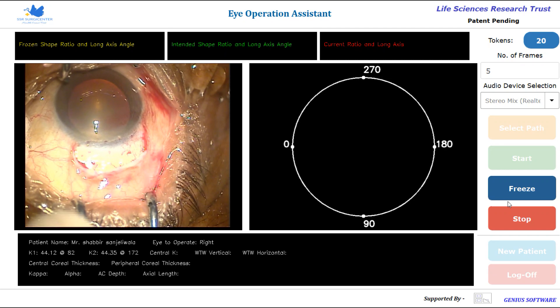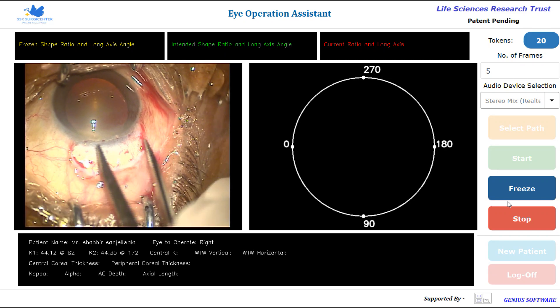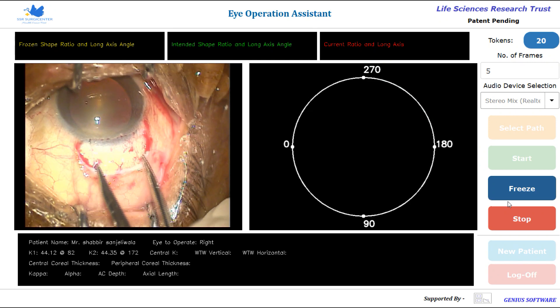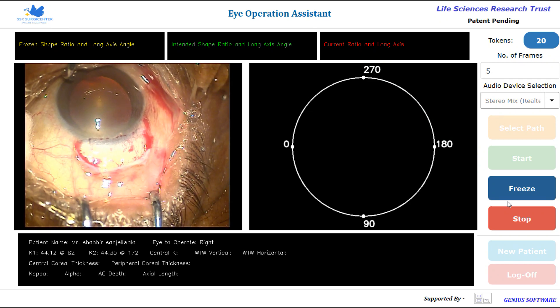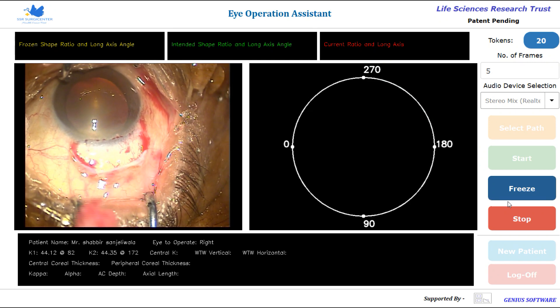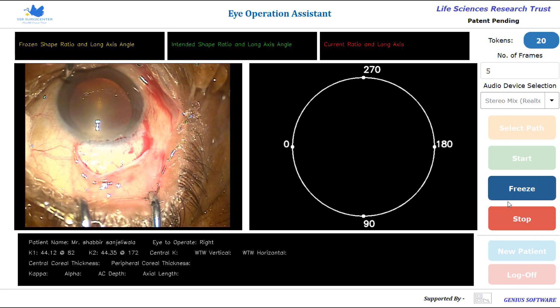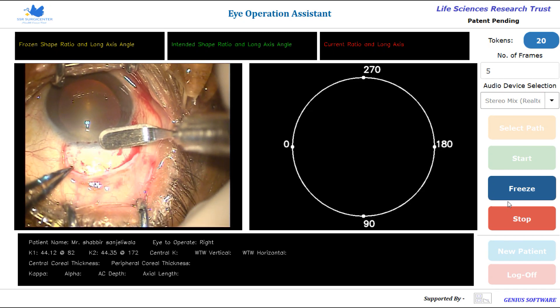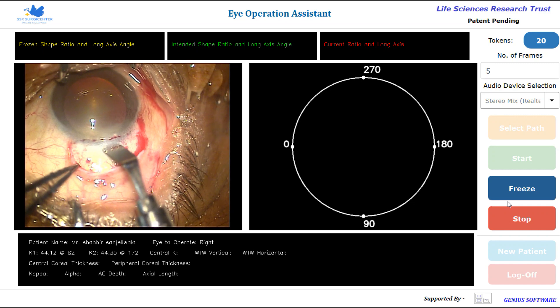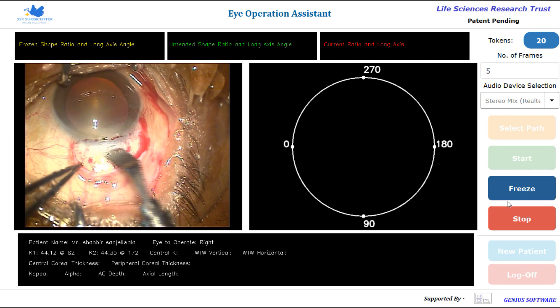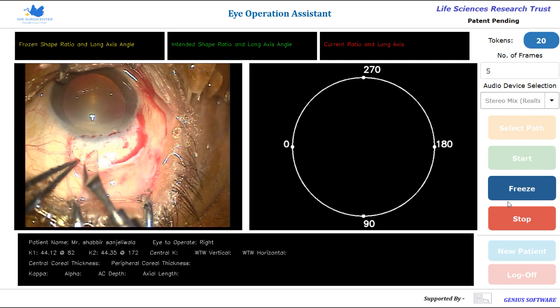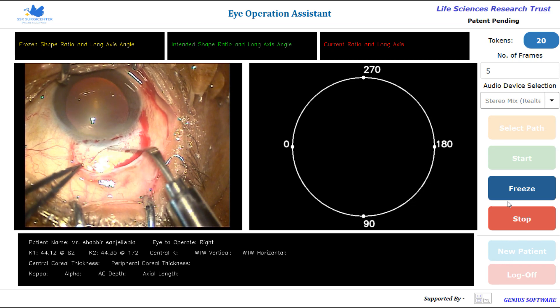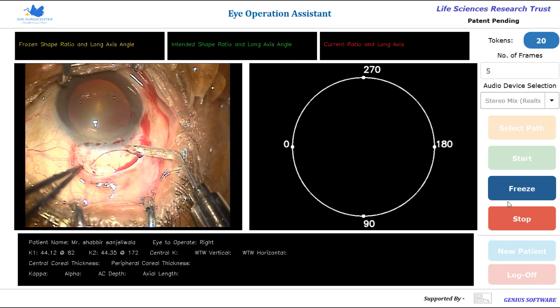This video shows K2K software guided SICS. The incision is always measured 6 mm and centered on the broadest limbus. The distance from conjunctival incision on the cornea is also always measured to be 1.5 mm in the center.